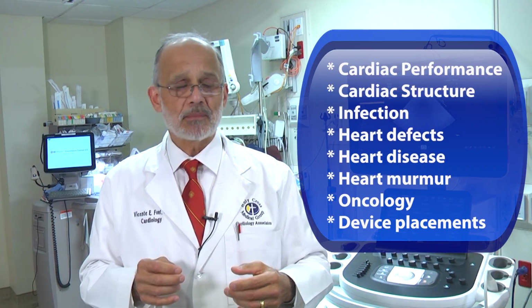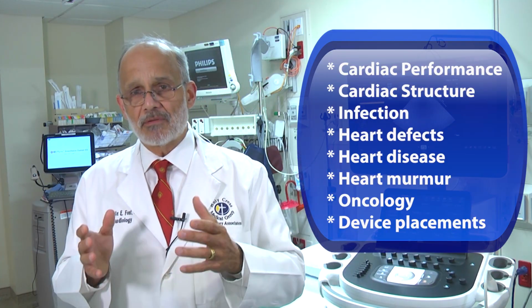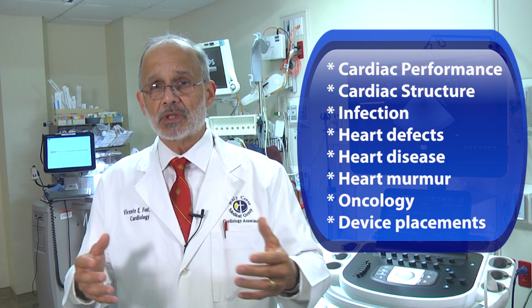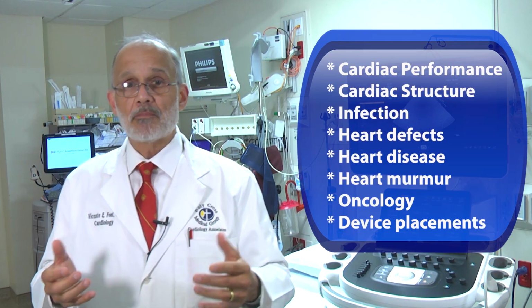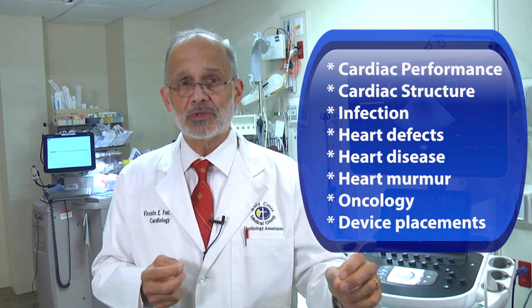It is also an important initial test. If you have, for example, somebody that you detect a heart murmur, this is the test, the gold standard test to do. Also, like I said, it's a very important test, and it's becoming a standard test for follow-up of many conditions. For example, in oncology, certain chemotherapy drugs are cardiotoxic, so these are very useful for follow-up. Important tool in the operating room, in the cardiac cath lab, in the electrophysiology lab, because it helps guide certain procedures like valve replacements and repairs, placement of devices like Watchman devices that we use for atrial fibrillation.